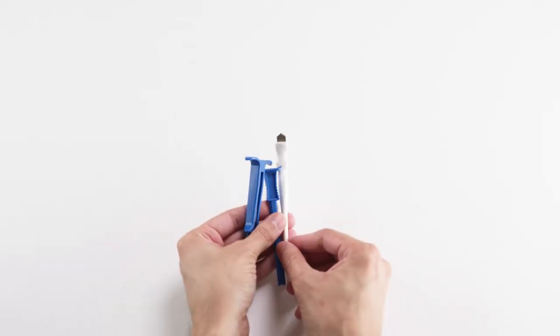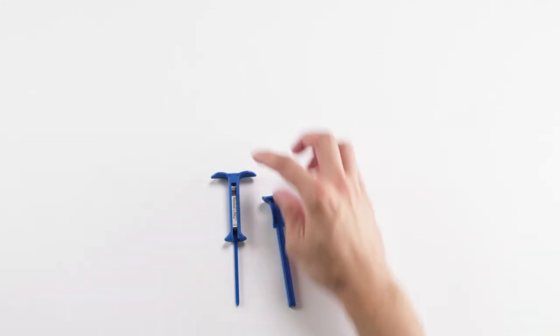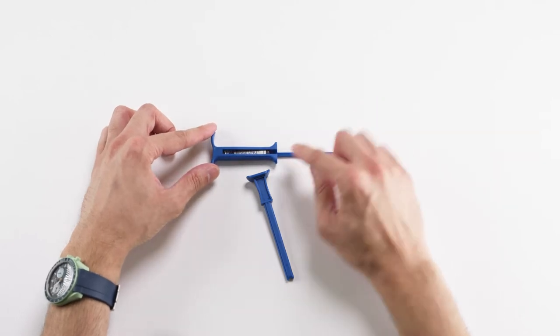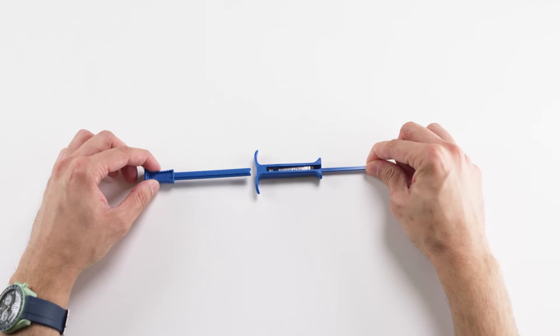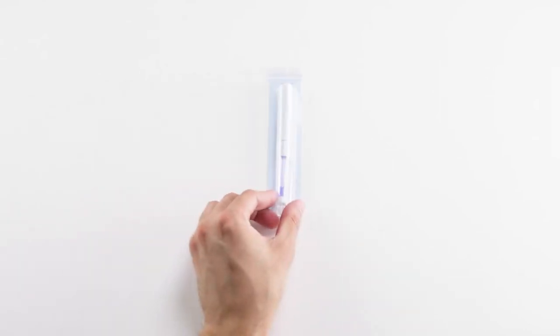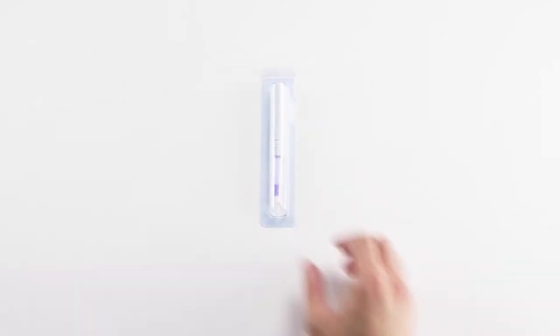And of course we have the sterile package insertion kit, which includes a puncture tool, which we'll use to make an incision on the skin. You have a preloaded RevealLink in the chamber with a tunneling end, alongside a plunger tool, which we'll use to insert into the patient. In anticipation of your closure technique, you want to have the appropriate materials ready. I like to use Dermabond for the majority of my patients; however, you can also use sterile strips, sutures, or any other technique you prefer.